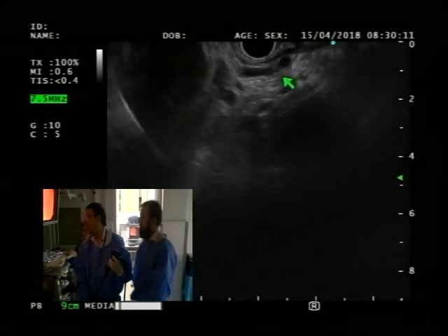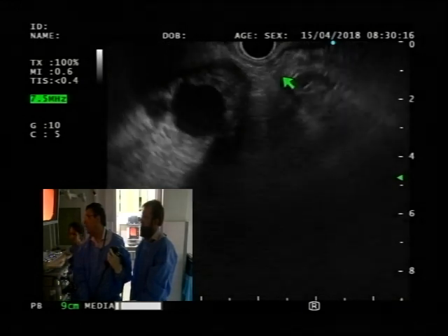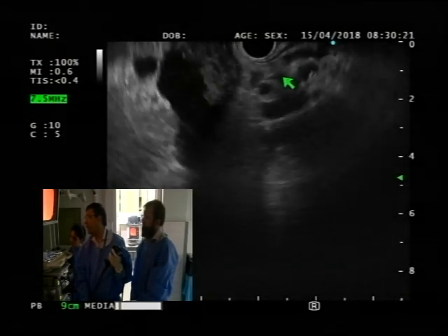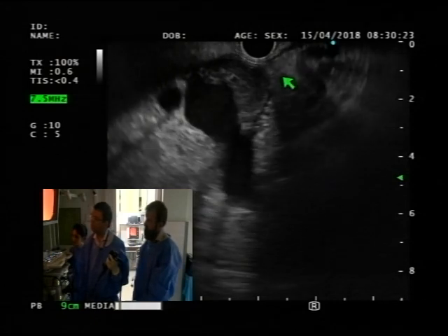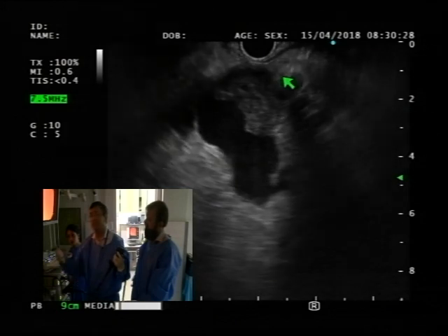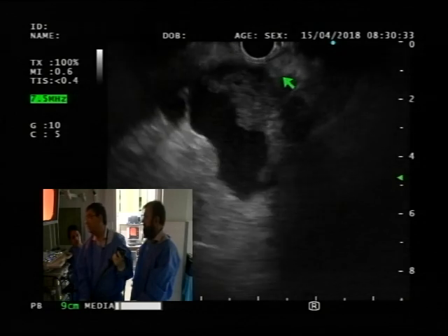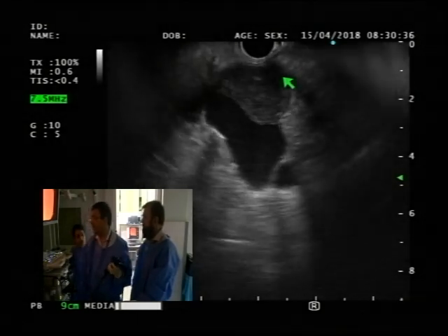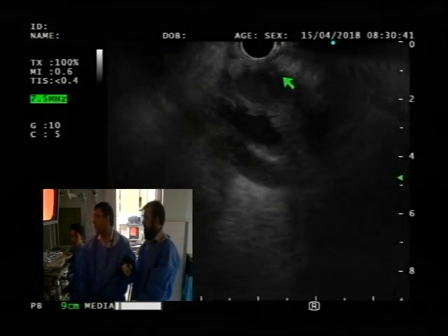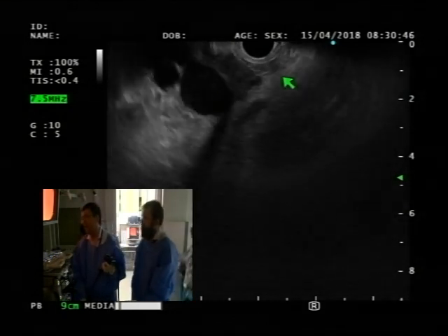Then you get into the collaterals, and from there you get straight to the clot. Those are all collaterals right here. The other difficulty: chronic pancreatitis, risk of splenic and portal vein thrombosis. Could it be that? Yes, exactly, I think that's what it is. With the collaterals and varices, this has to be just a clot due to chronic pancreatitis. So I don't really appreciate any mass there.